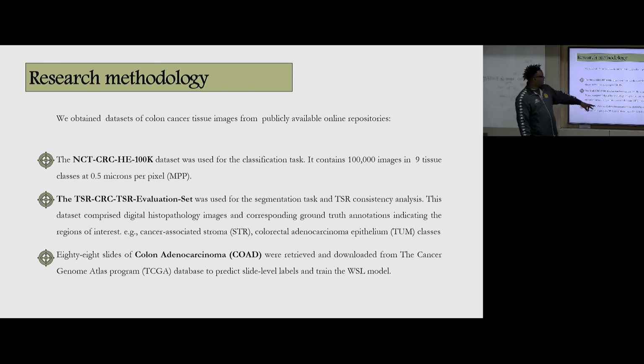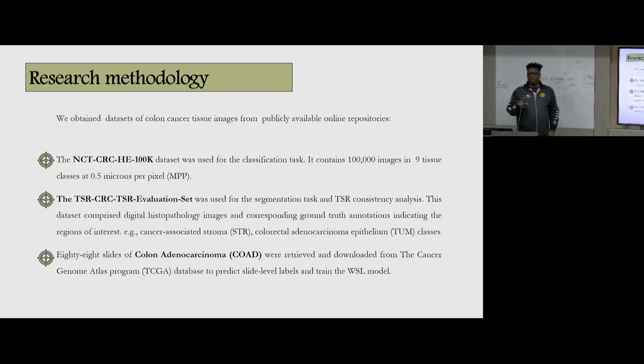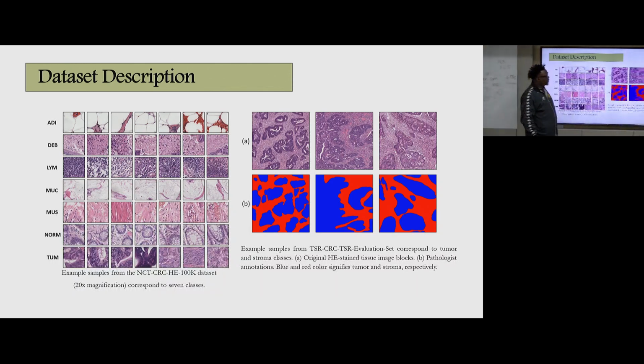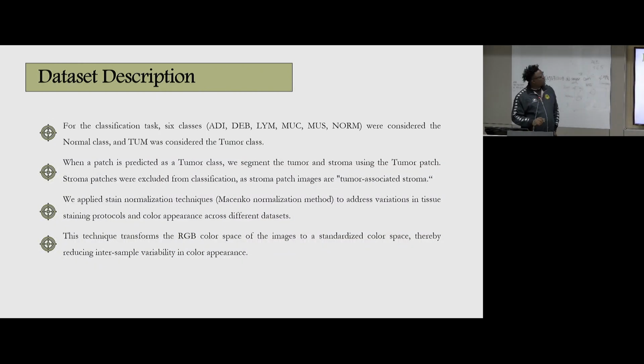So it resulted in 88 slides of colon cancer. These 88 slides came already with some kind of annotation, normal and tumor. So I will show you what happened to those. I downloaded them from a public data set. So this is the data, and then this is the prediction, the segmentation data set. And some consideration you can do depending.